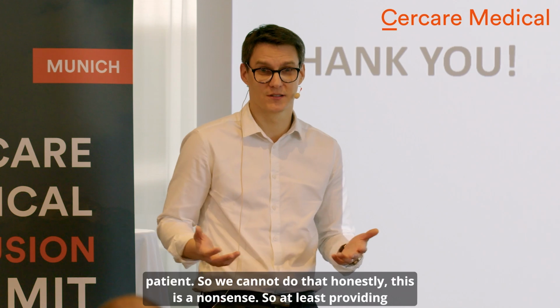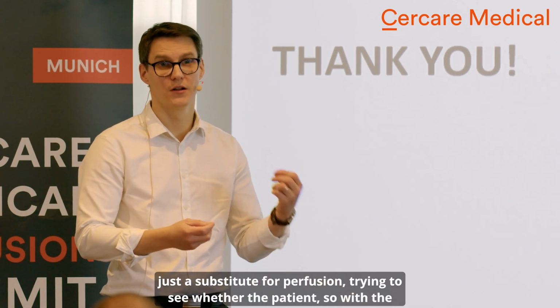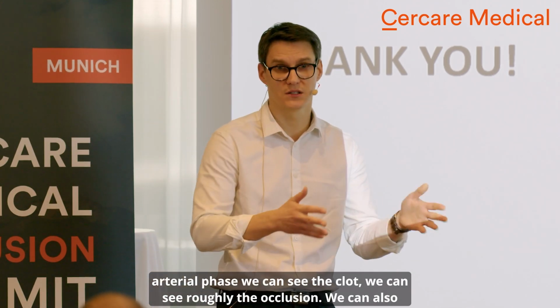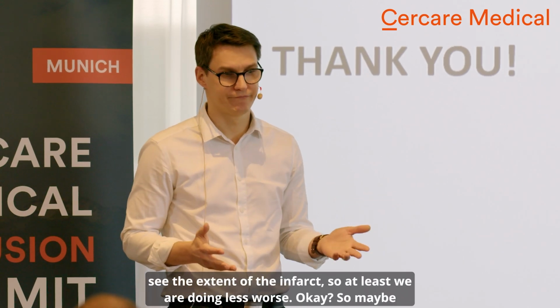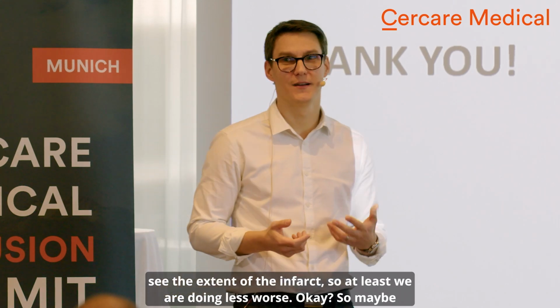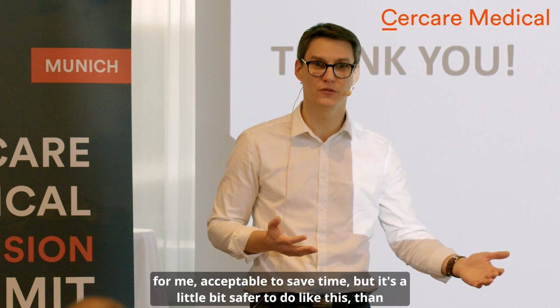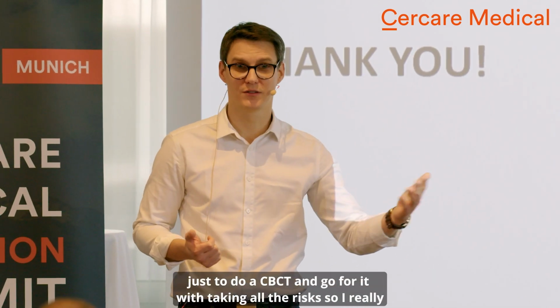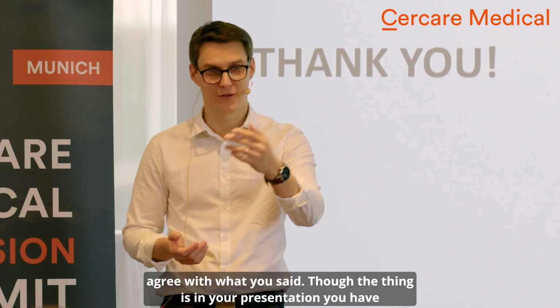This is nonsense. So at least providing just a substitute for perfusion, with the arterial phase, we can see the clot, we can see roughly the occlusion. We can also see the extent of the infarct. At least we are doing less worse. Okay, so maybe for me acceptable to save time, but it's a little bit safer to do it like this than just to do a CBCT and go for it, taking all the risks. So I really agree with what you said.